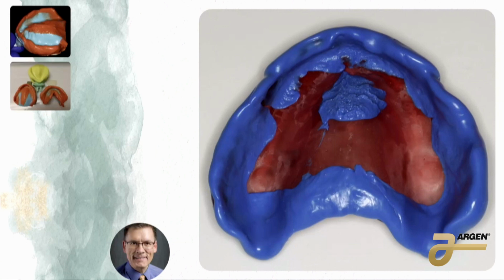He does a functional post-dam, so he also puts it in the back, which I will talk about in a minute. And once it's in there, he makes his patient go ooh, ee, ah. They move their tongue around. What that's doing is, when you do that, your frenal attachments, your tissue, it's moving around. So we're capturing something hard and plastic in each of those movements.